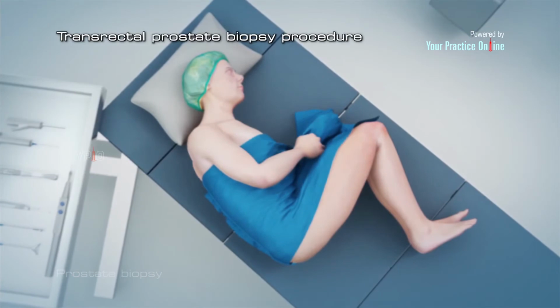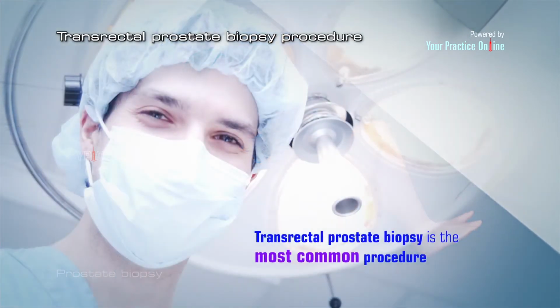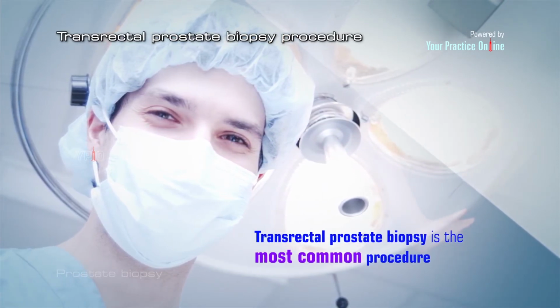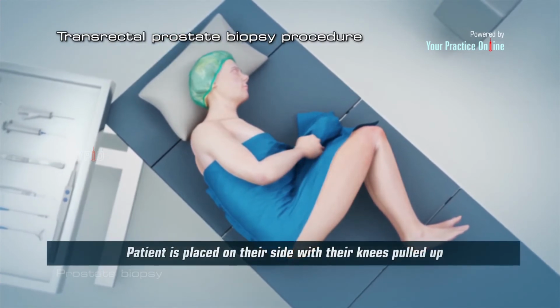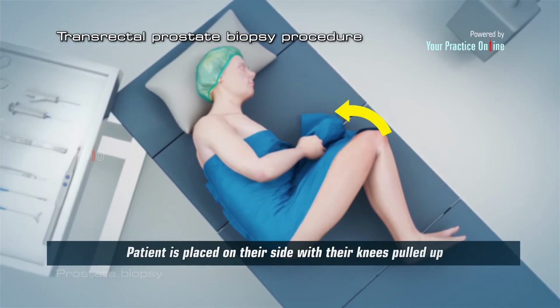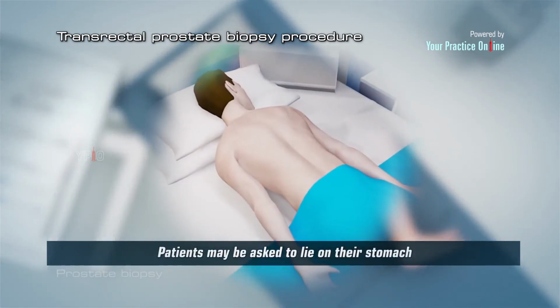Transrectal prostate biopsy procedure. Transrectal prostate biopsy is the most common procedure employed by urologists. During this procedure, the patient is placed on their side with their knees pulled up against the chest. In some cases, patients may be asked to lie on their stomach.